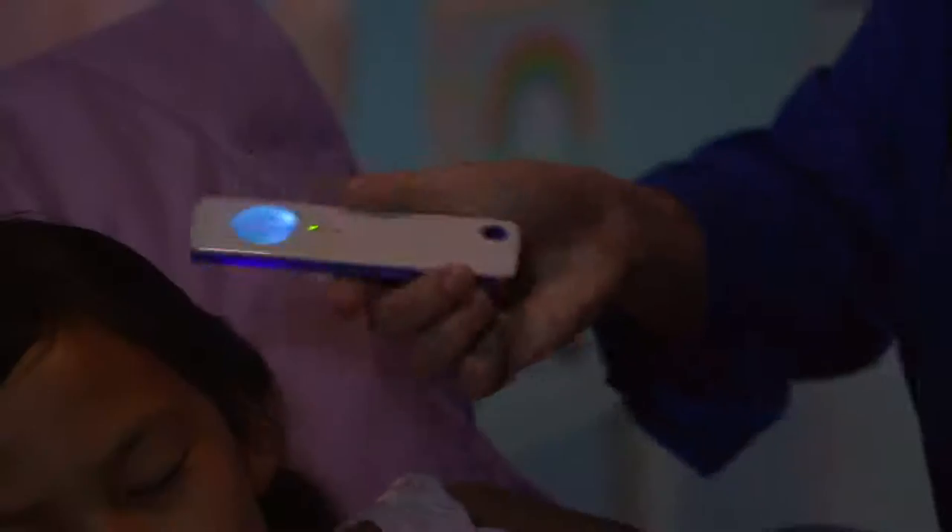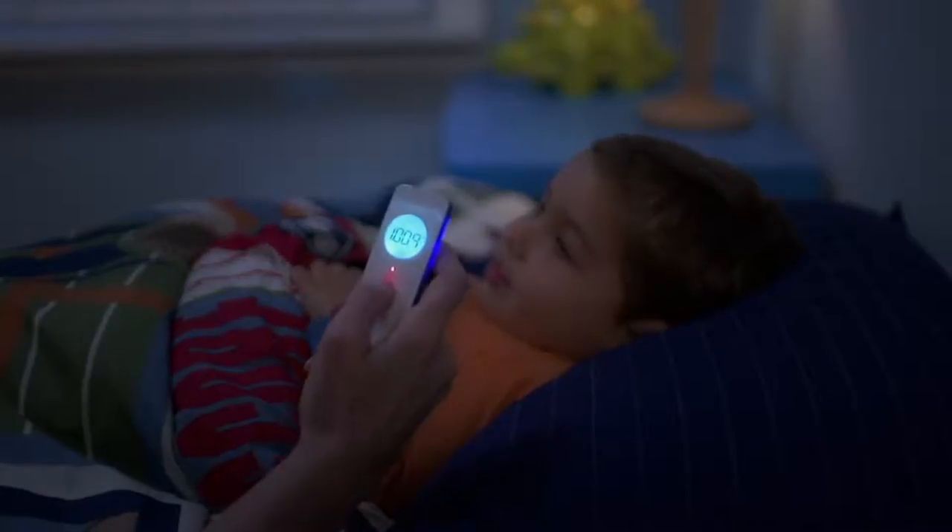Things are better that are newer, and this is the newest technology. There's no replaceable battery — I used to think, oh wait, I don't know the last time I changed these batteries. With this, you don't have to worry about that. The battery is embedded in the unit itself because it's a medical device and it's clinically accurate. Just one press — quick, fast, easy, and accurate. If you didn't do it right, it'll say low, but it is super easy to use. One button. V32974 is your item number for the no-touch thermometer.